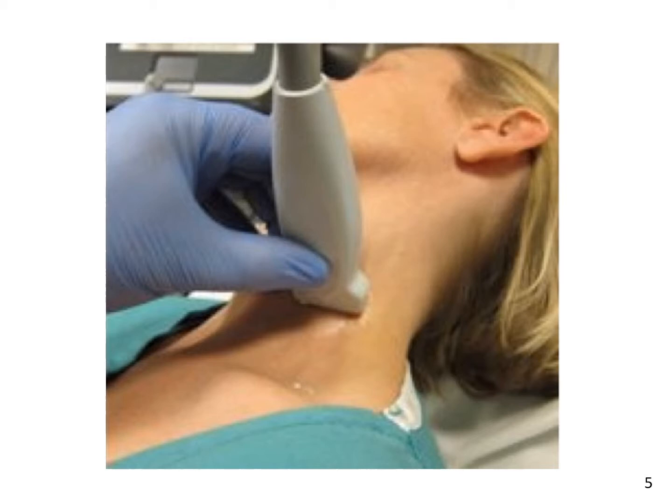To identify the brachial plexus at the level of the scalene muscles, place the linear probe transversely on the neck over the carotid artery and the internal jugular vein. You can start about halfway up the neck, slide lateral to identify the anterior and the middle scalene muscles. The brachial plexus lies in the fascial plane between these muscles. Alternatively, you can find the brachial plexus just superior to the clavicle and trace these nerve roots up into the mid-neck as shown here.